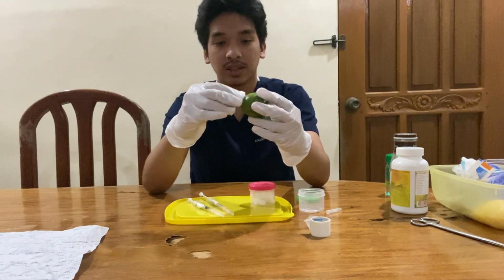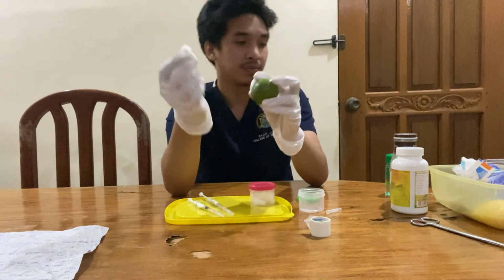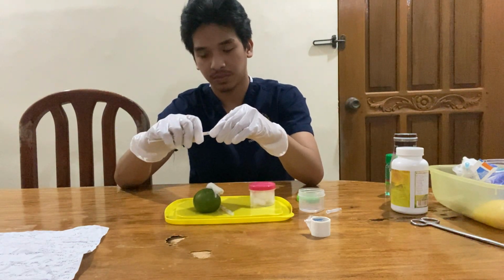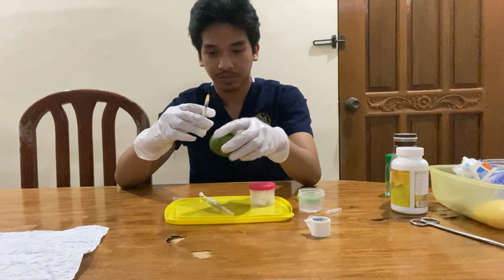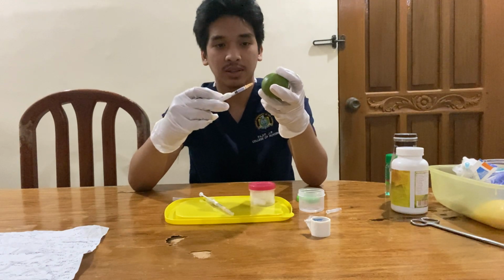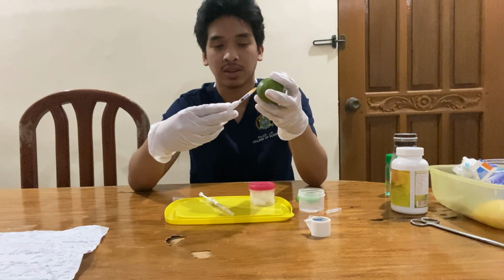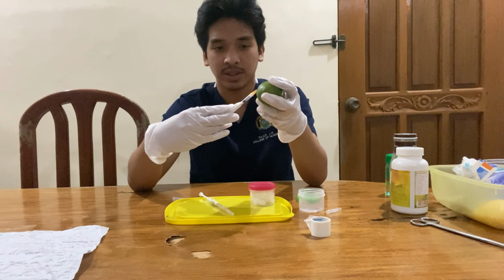Just clean the site. To clean the site, go from inside going outside. Okay, now we're ready to inject. So as we inject this, it will be angled 45 degrees. Okay, so we're gonna inject it now. This one we don't have to aspirate. Wait for 5 to 10 seconds. Then I'm gonna inject it slowly.